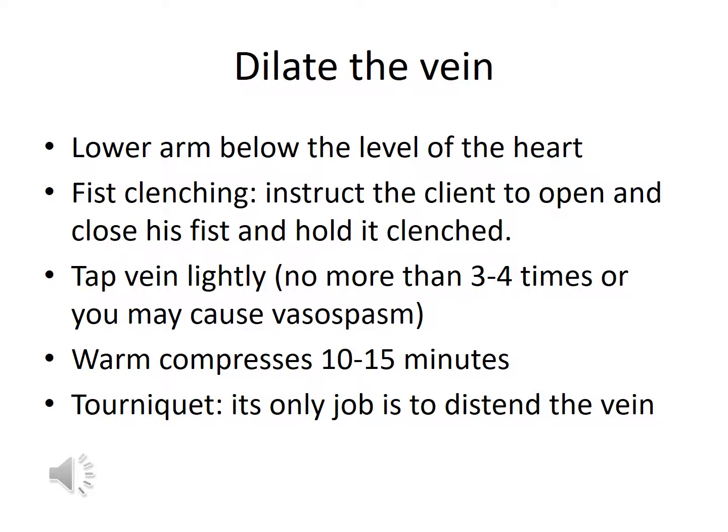You just want to tap the vein lightly. Don't smack it hard, no more than 3 or 4 times, or you can actually cause a vasospasm, where you'll see the vein jump up and look like it's really big, but when you go to stick it, it's going to be very difficult. Sometimes a warm compress, a warm washcloth, you just warm it up and put that on there for 10 or 15 minutes. It'll make it nice and easy to dilate the vein.